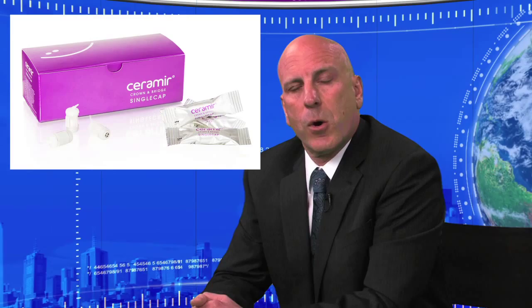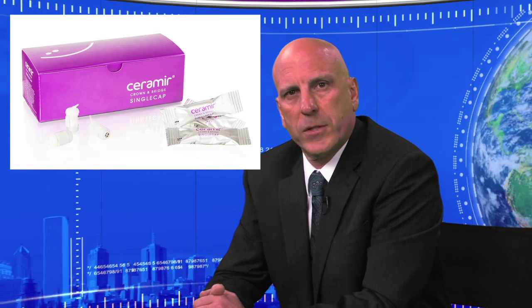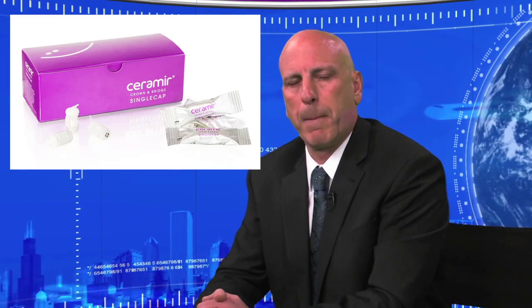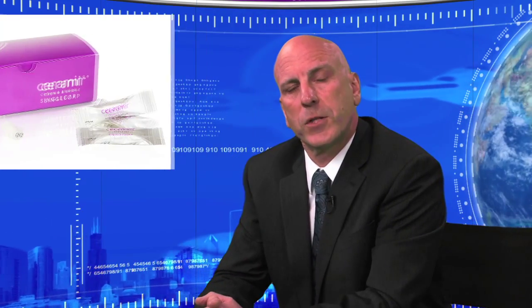Now, that all sounds like a lot to do, and some people see that it is. You could also go with a cement called Ceramir, from Doxa, a Swedish company. And this also works very well with Bruxer, but it's got a different way that it bonds to the Bruxer crown. It doesn't use phosphates. It has to do with the fact that it's a hydrophilic cement that forms these nanocrystals.